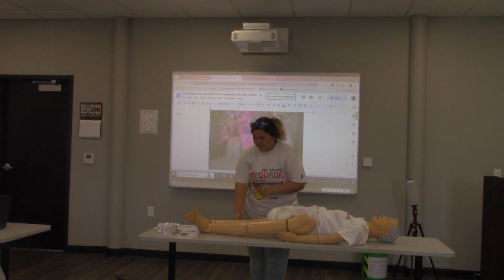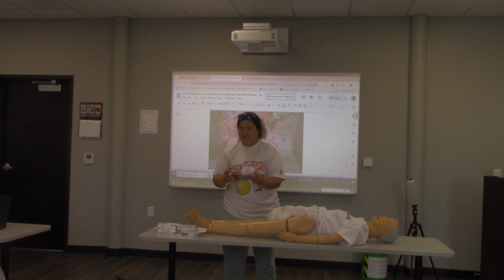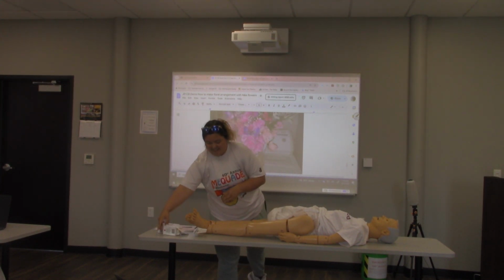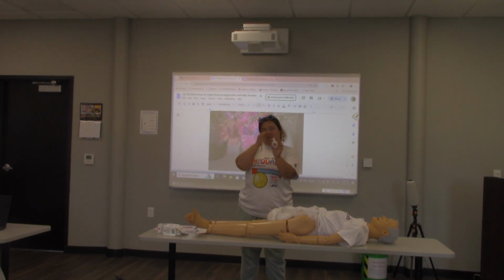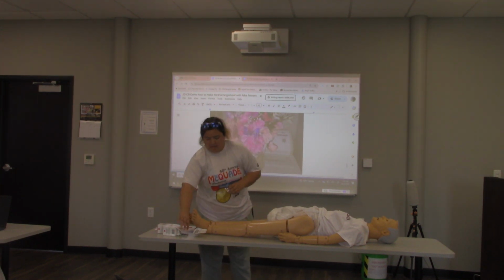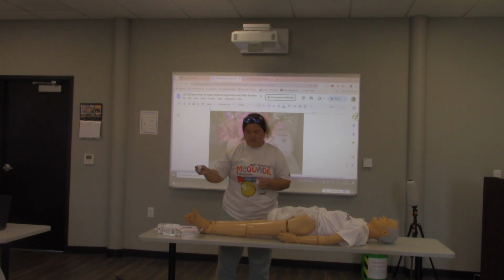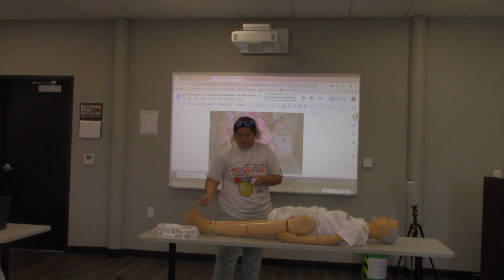And then the next step, you want to check your box and make sure it's not out of date. I grabbed out of date ones because I was like, whatever. And so this is what Narcan looks like. It's just little things. Some have caps, some don't. Mine don't have a cap because it's just faster. They come with instructions, 1, 2, 3, 4, 5, just like what I'm doing. And then they also have different things on the back.